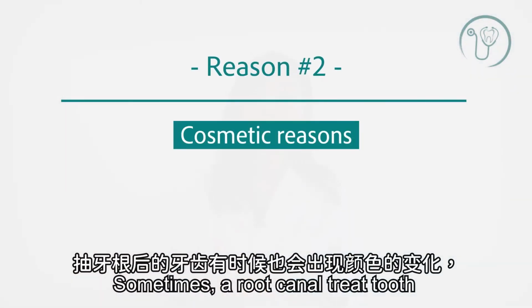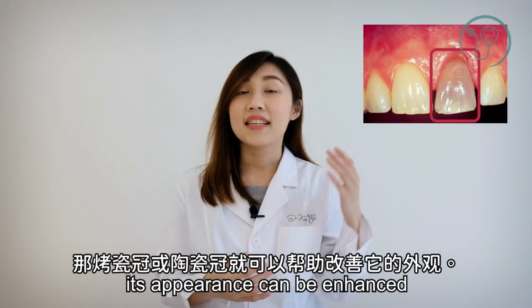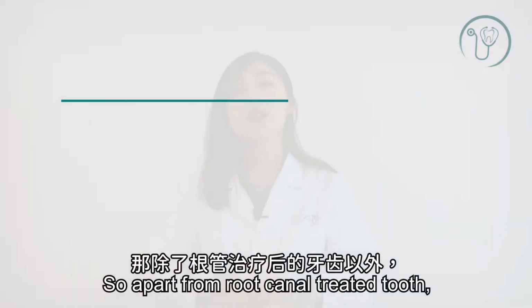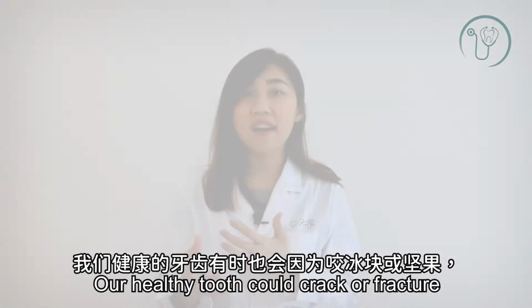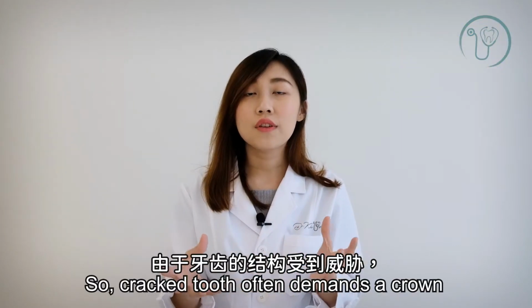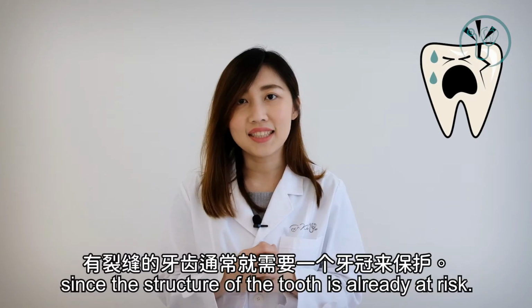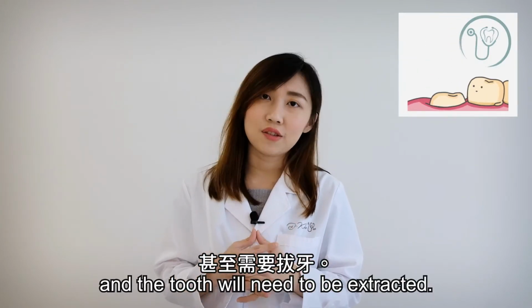Sometimes a root canal treated tooth may present with color changes like this. Its appearance can be enhanced by a porcelain or ceramic crown. Apart from the root canal treated tooth, our healthy tooth could crack or fracture due to ice chewing or nuts chewing or even grinding at night. A cracked tooth often demands a crown since the structure of the tooth is already at risk. Otherwise, the crack will become worse and the tooth will need to be extracted.